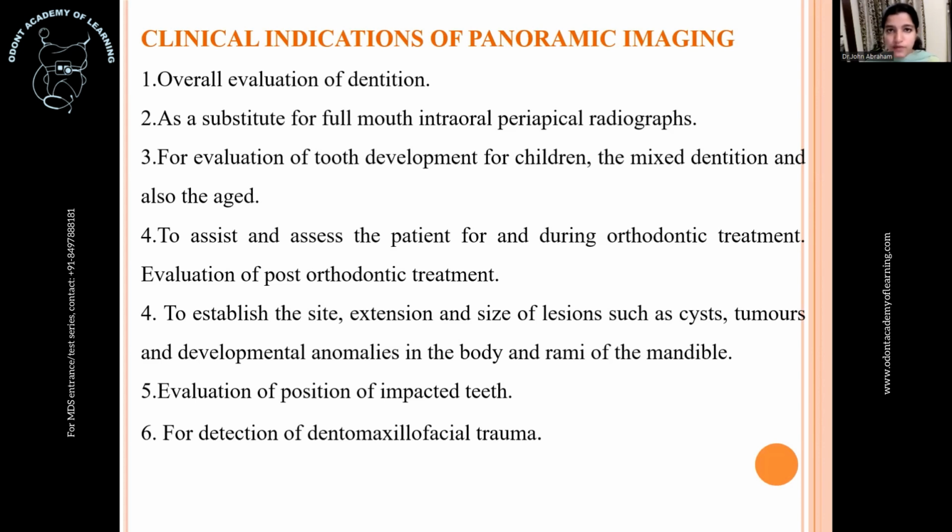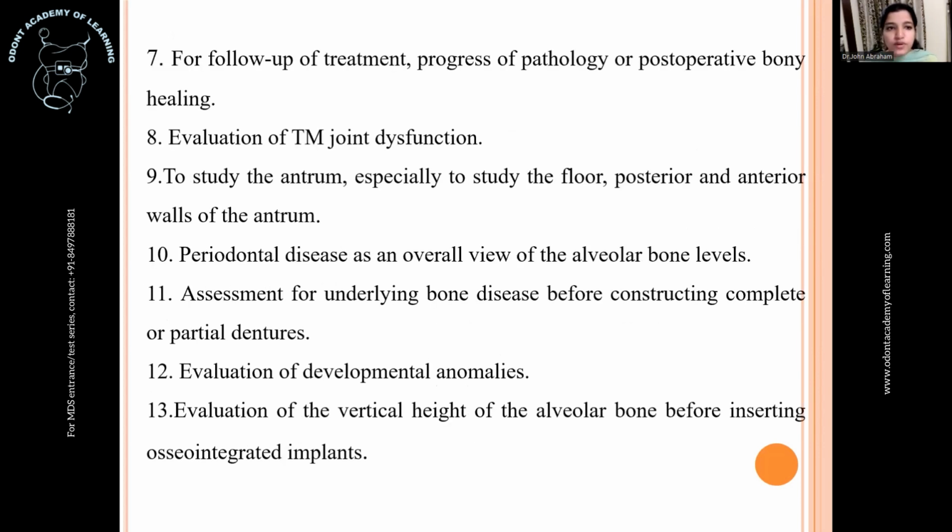So, of course, we can visualize the extent a lesion covers in our maxilla or mandible, evaluation of the position of an impacted tooth, detection of maxillofacial trauma, and for follow-up treatment, progress of pathology or post-operative bony healing. Of course, after a surgery or after treatment, we can do a follow-up evaluation with the help of panoramic imaging.